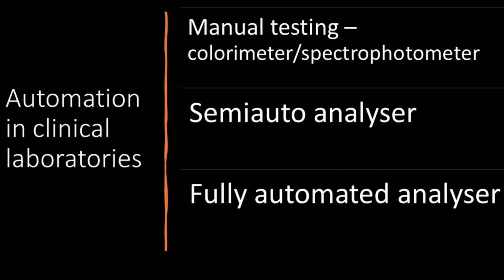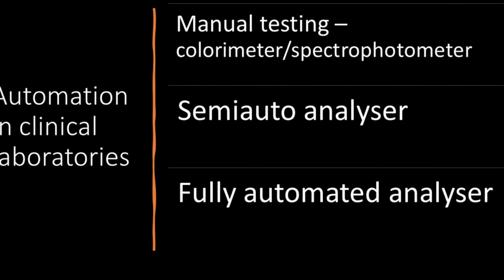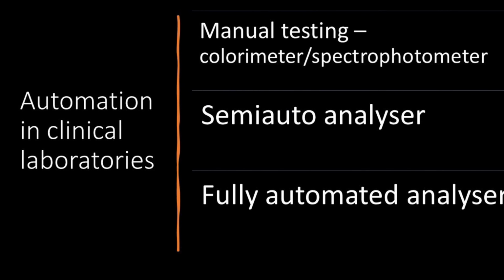Automation in clinical laboratories over the years, with the advent of technology, has seen a shift from manual testing using colorimeter to a fully automated analyzer.